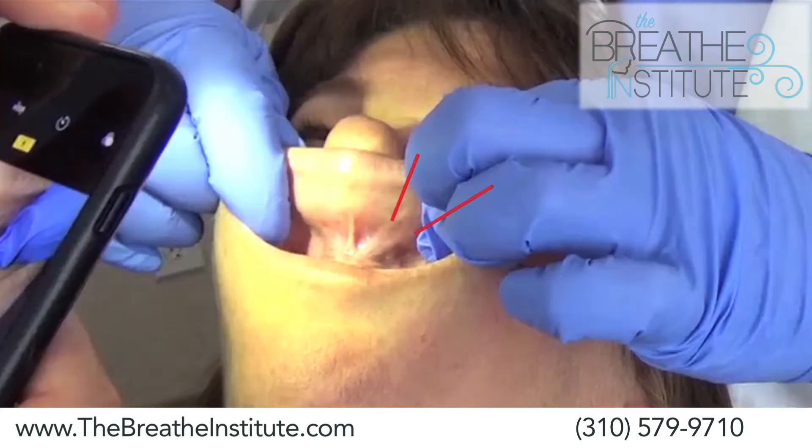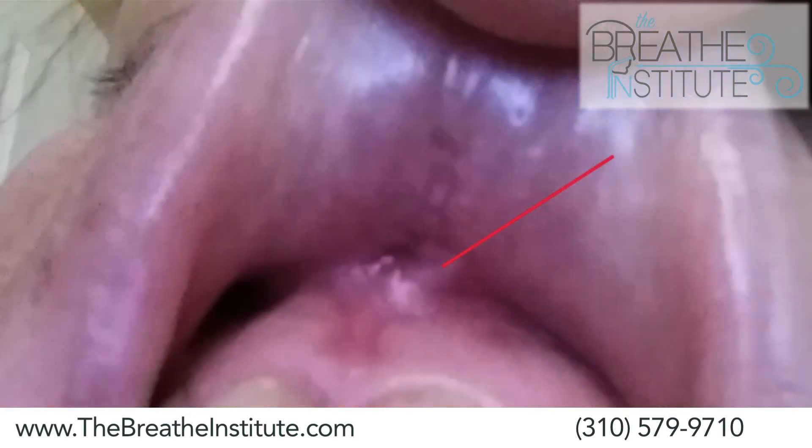This is the same patient at five weeks. You can see there's been a lot of reattachment. This is the same patient after Dr. Zaghi redid the procedure. This is also day 10, and you can see in contrast there is no scar tissue.